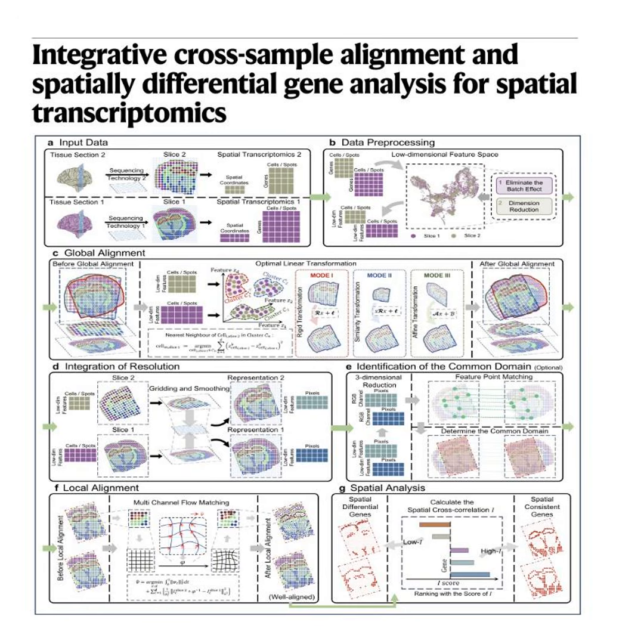Okay, so we've spun the map right side up, fixed the silly putty stretching, and cropped the edges so the boundaries met perfectly. But tissue is messy. Even if the borders match, the cells inside are still full of micro tears and localized warps from being on the lab slide. How do you align the internal cellular streets? This requires local alignment, and this is the heavy lifter of the framework. CODA applies something called multi-channel LDDMM.